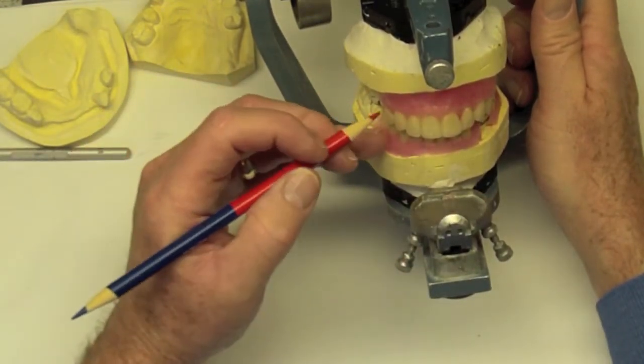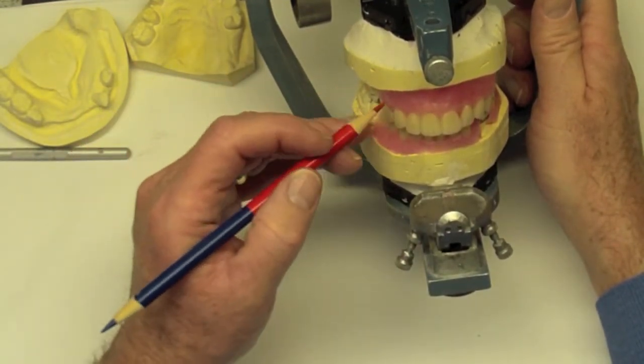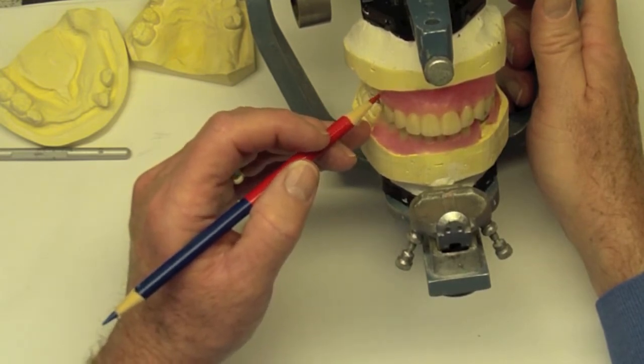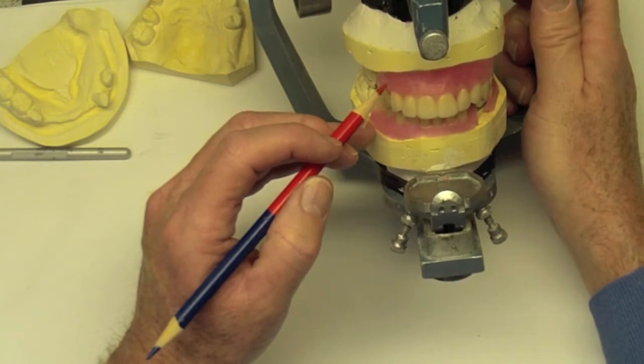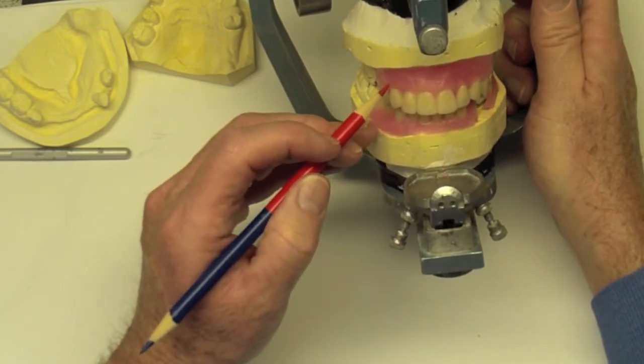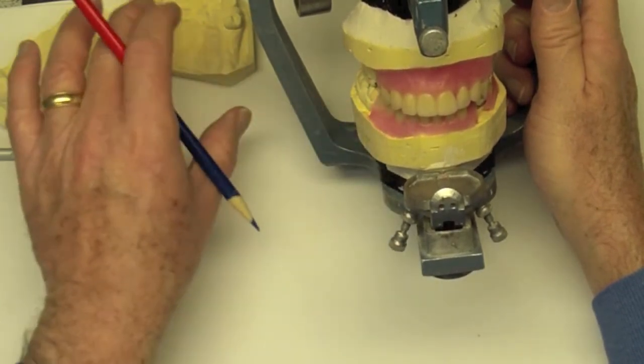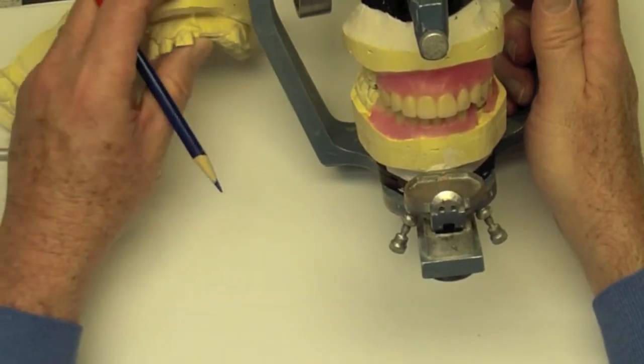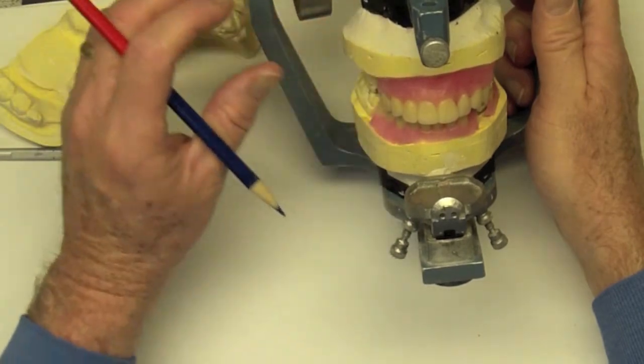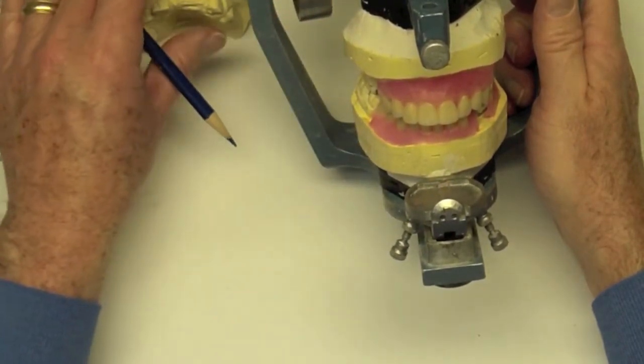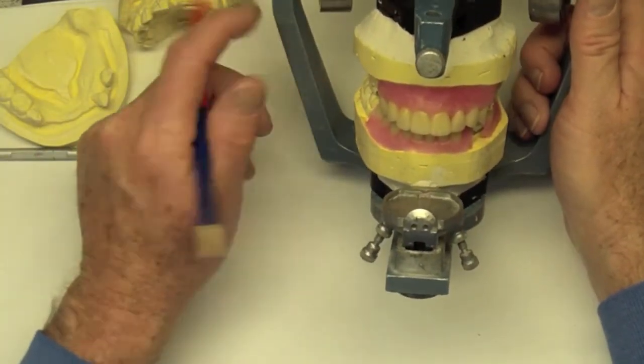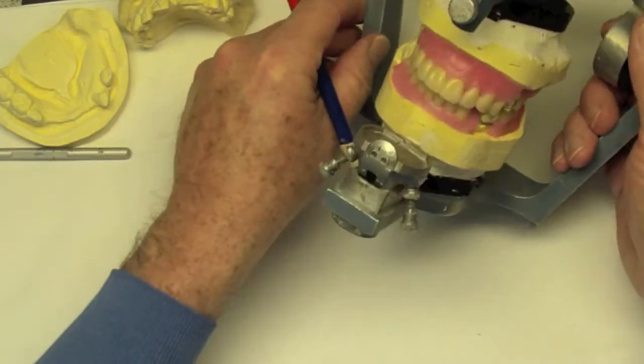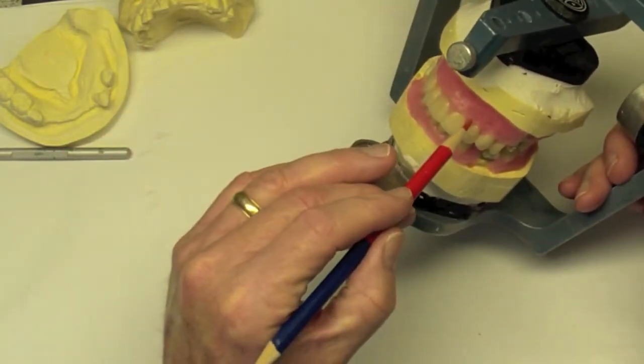This is waxed all the way up into the vestibule, but it'd be difficult to insert that. So in the interest of time and multiple adjustments, what I'm going to do is go ahead and contour these areas back. So it's basically butting up against this anterior ridge and, of course, as the patient heals, we're going to get some shrinkage of the soft tissue as it remodels. And with that said, I'll probably be using some kind of reline material until we have adequate healing.